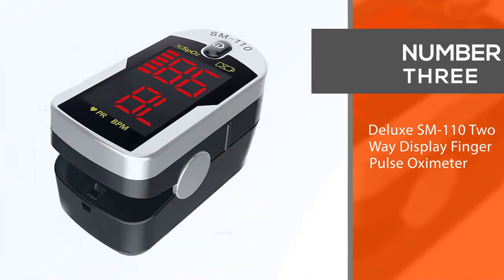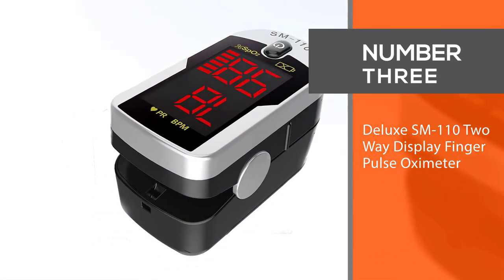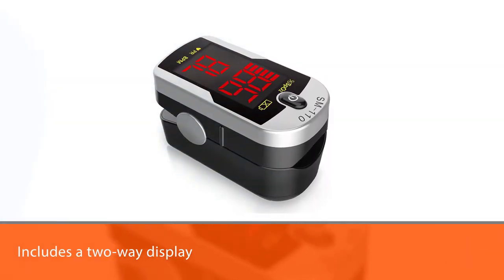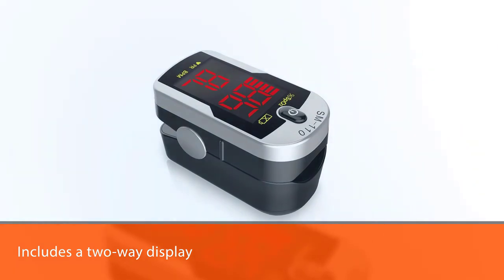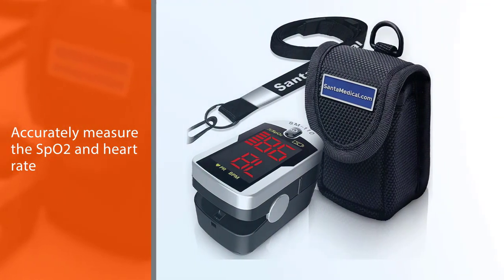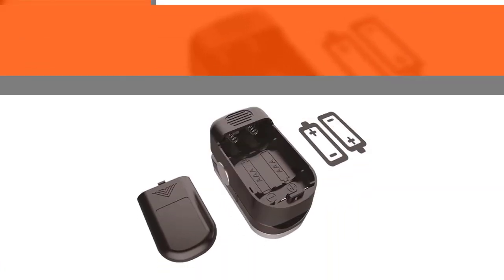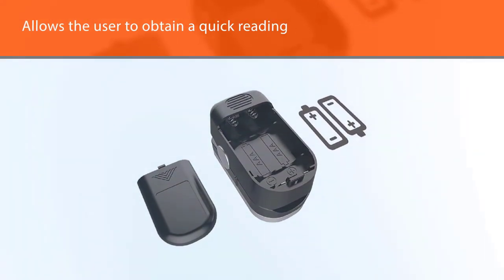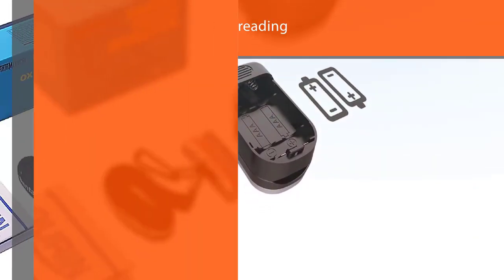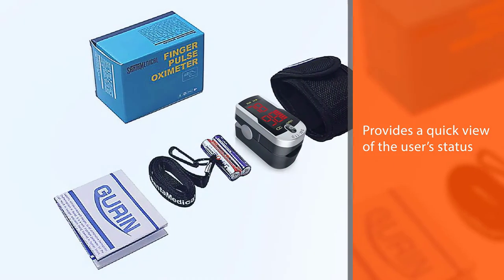Number 3. Deluxe SM110 Two-Way Display Finger Pulse Oximeter. This one is a very popular pulse oximeter because it includes a two-way display that allows the oximeter to be read in either direction. It can easily and accurately measure the SPO2 and heart rate, allowing the user to obtain a quick reading. It has a bright LED display that provides an easy viewing experience that works well in both light and dark situations.